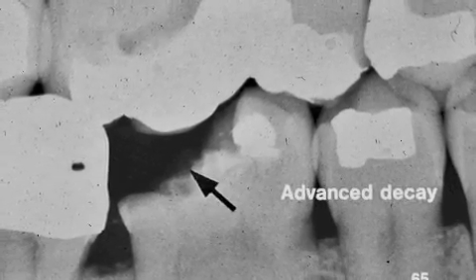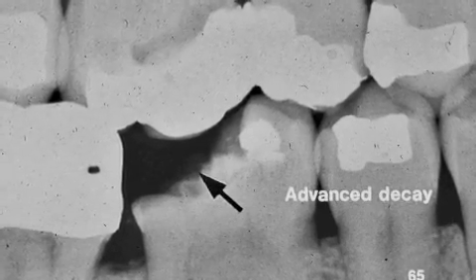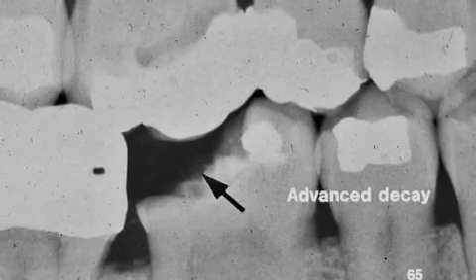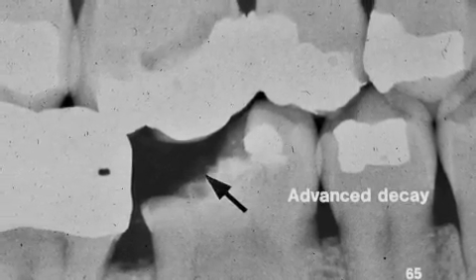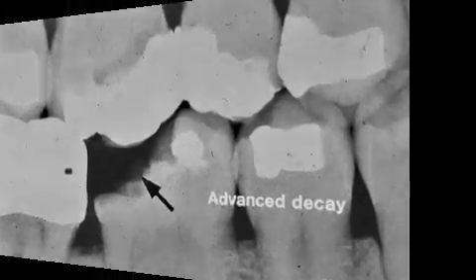Above number 30, can you see the radiolucency next to the opacity of the restoration? Recurrent caries are next to an existing restoration. This is tooth number 20 — the arrow points to the recurrent caries.